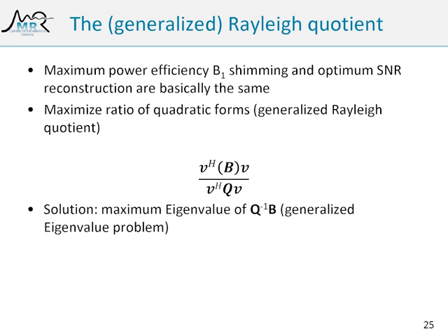So it's just a vector with the elements B1 field of coil 1, B1 field of coil 2, B1 field of coil 3, B1 field of coil 4, and so on. Okay, and so when you want to combine the signals for reception from all those coils, you have to apply a scaling factor to each of them before you add them together.